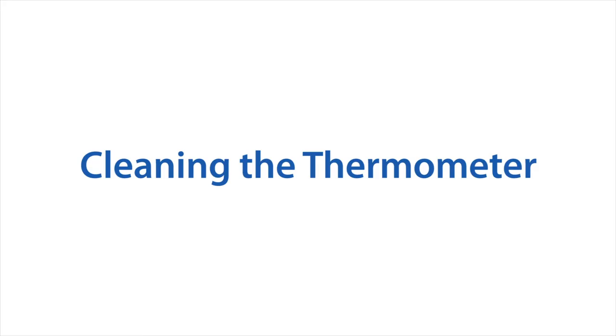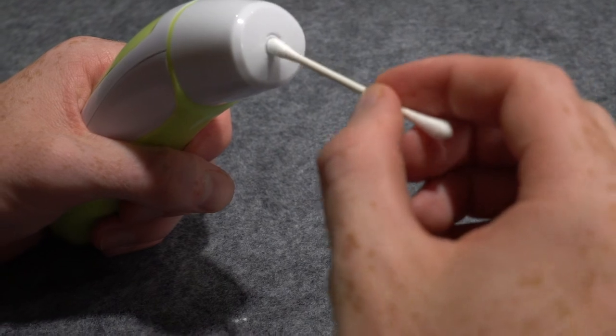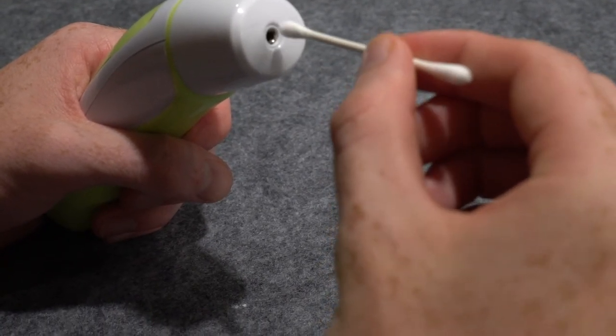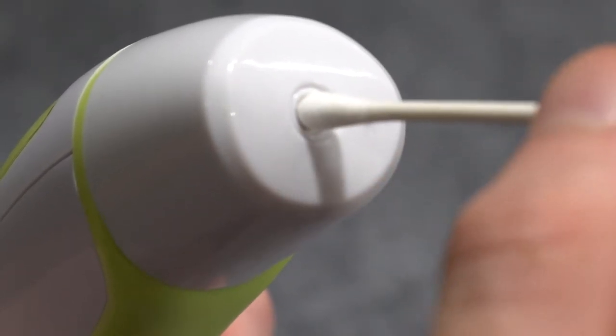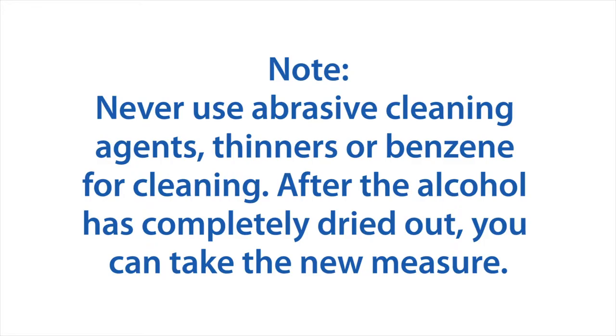Cleaning the thermometer: the sensor is the most delicate part of the thermometer and must be cleaned and intact to ensure accurate readings. Use an alcohol swab or cotton swab moistened with alcohol to clean the thermometer sensor. Ensure that no liquid enters the interior of the thermometer. Never use abrasive cleaning agents, thinners, or benzene for cleaning.